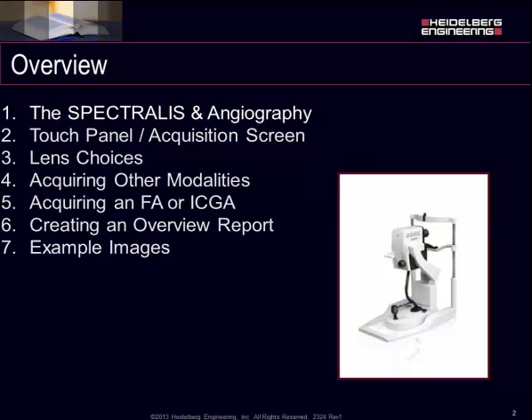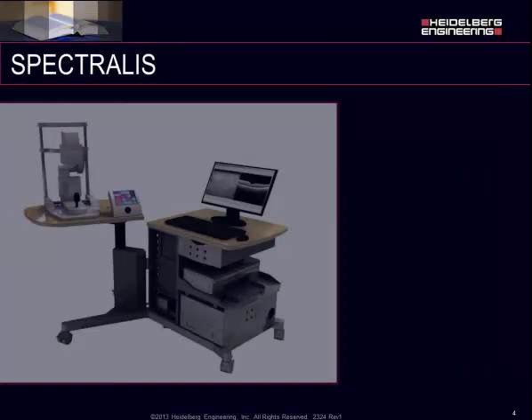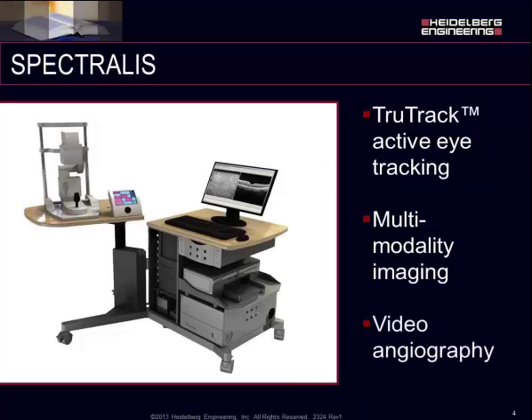So to start, we're going to look at the SPECTRALIS and angiography. As you all probably know, the SPECTRALIS has the TrueTrack eye tracking, which makes all your images nice and clear. We're also able to do multiple different imaging modalities at the same time. And you're also able to do videos for the transit phase of the angiographies.